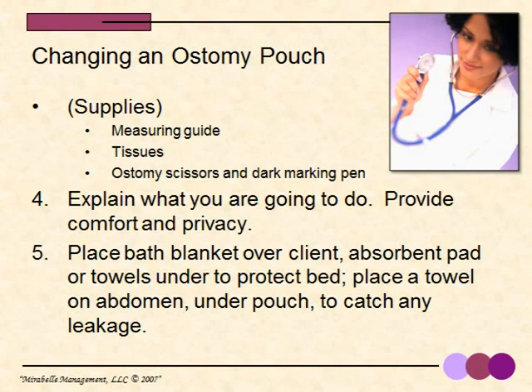You will need a measuring guide to be able to cut the opening of the pouch to fit the stoma, and a box of tissues, and then your ostomy scissors and a dark marking pen. As always, explain what you're going to do and provide the necessary comfort and privacy for your client. Place a bath blanket over him or her and an absorbent pad or towels underneath just to protect the bed in case there's any spillage.